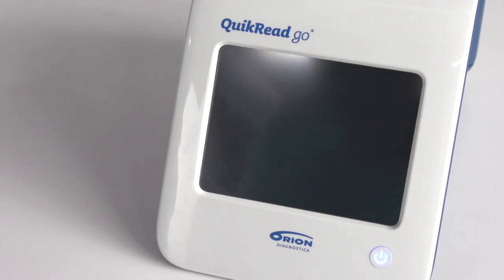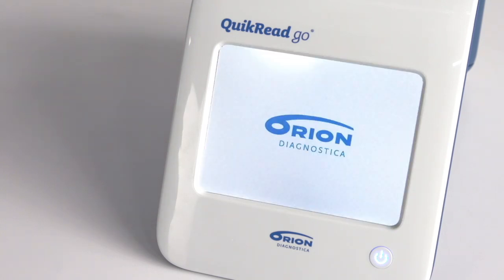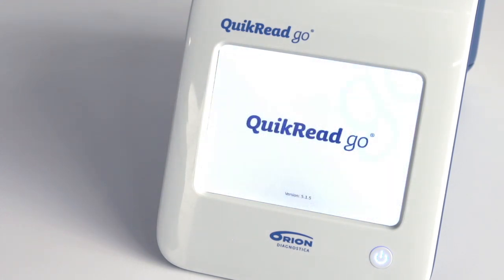A light on the power button will indicate that the instrument is powered on. Orion Diagnostica and Quick Read Go logos are first shown on the screen. Please note that the instrument software version is also shown under the Quick Read Go logo.